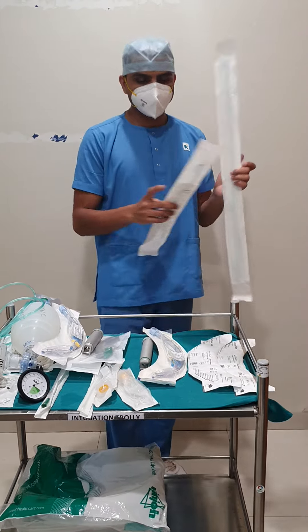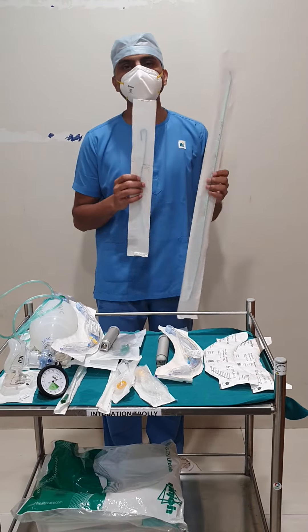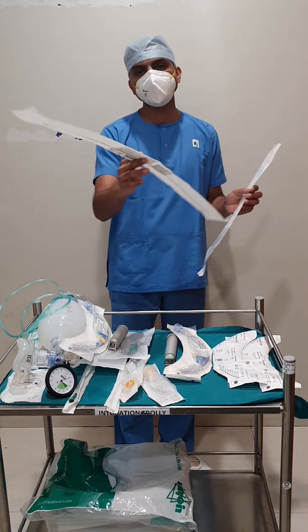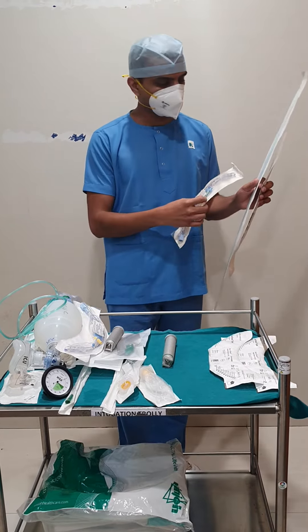This is a bougie and this is a stylet. Bougie and stylet are used for difficult intubation where the trachea is not visualized properly. The doctor will insert the bougie through the trachea and then slide the endotracheal tube over the bougie.